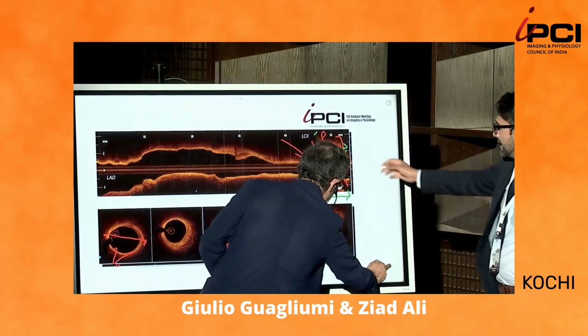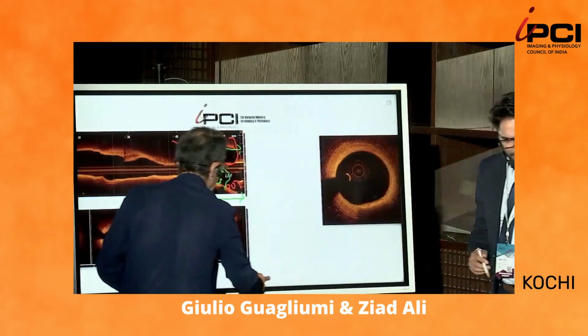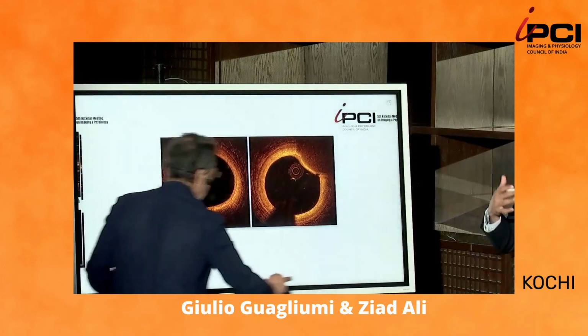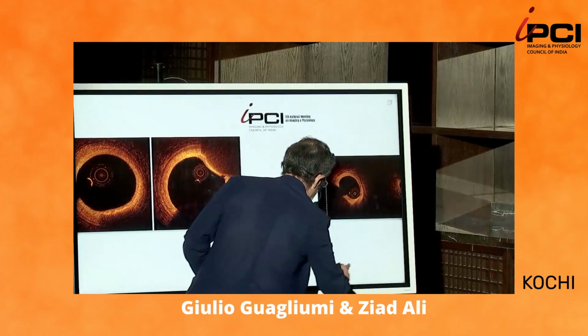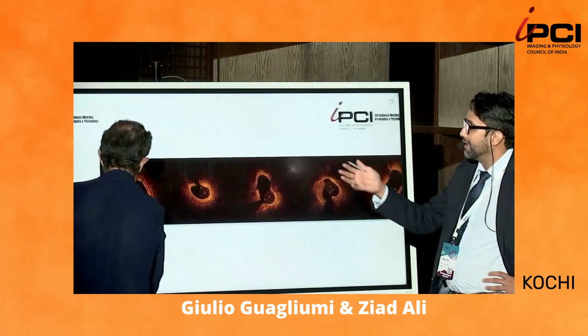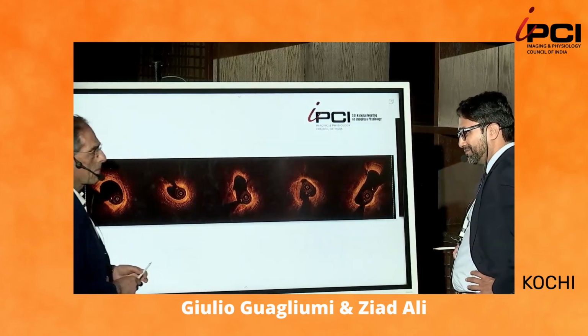I also need to think, what size stent am I going to be putting here? Is this a 3.0 that I can take to 5.5? Or I might only be able to take to 3.5, where I mangle my stent and elongate it. And then, Giulio, I'll have the same problem, but then it'll be in the aorta.